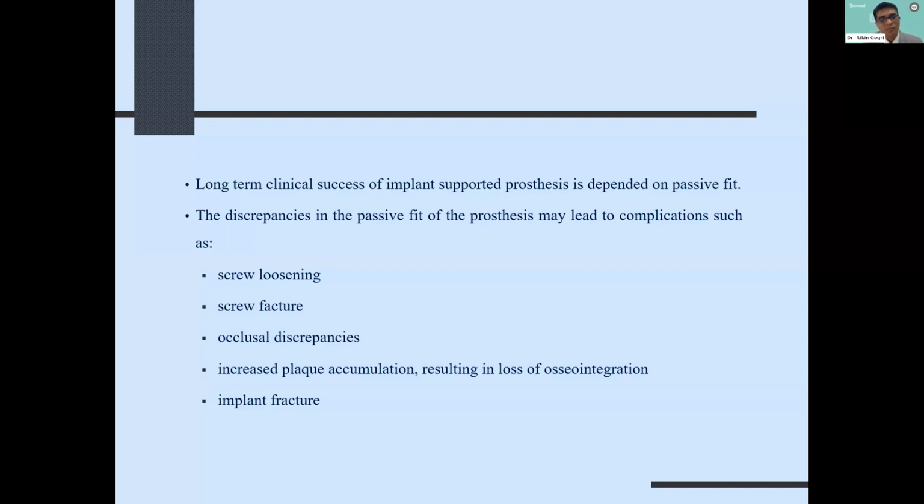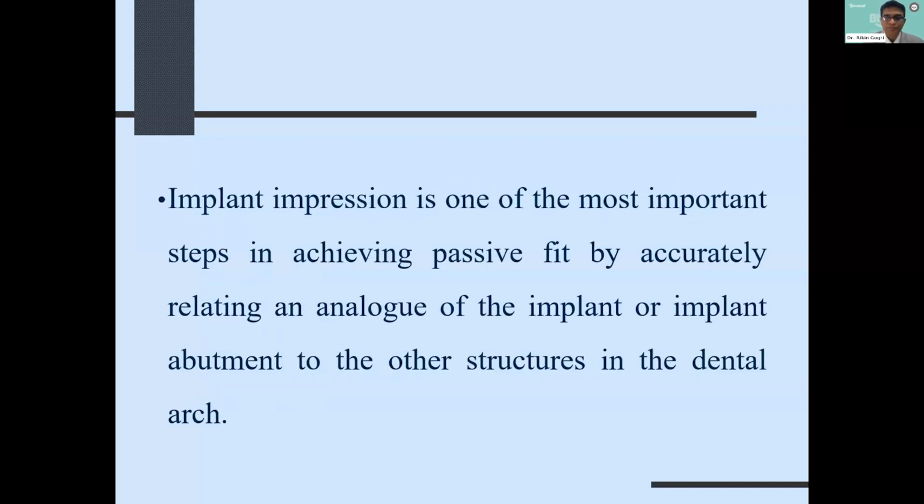And a lot of times, if the patient feels that, oh, I have an implant, it's moving, it's fine, but I can eat, they continue using the implant with the loose prosthesis. And what happens is the implant collar, if it's a thin implant, can give way and you have an implant fracture, which again means either you leave the implant the way it is, or you have an explantation procedure where a lot of bone around the integrated implant has to be removed for the fixture to be retrieved and a new fixture, if bone is available, can be placed.